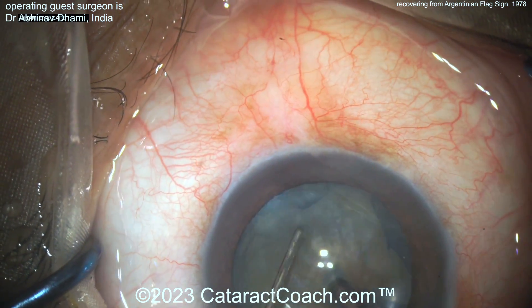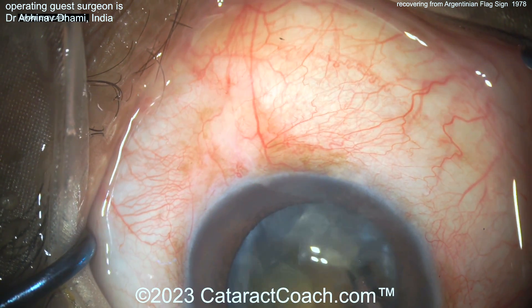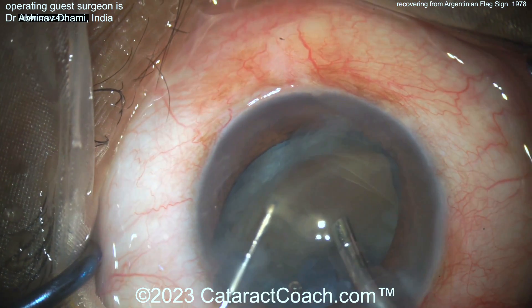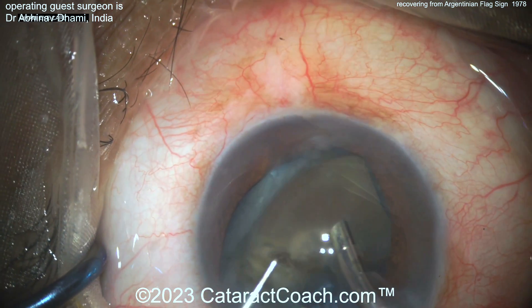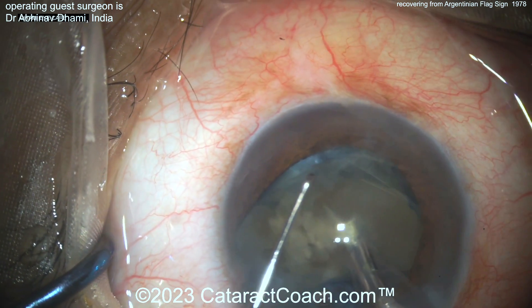The surgeon is obviously talented here — going to do a chop technique. Get that nucleus split and be cautious. Look at that: if you put stress on the bag, you can have it rip all the way back. This nucleus can be on the macula before you know it. Be careful.